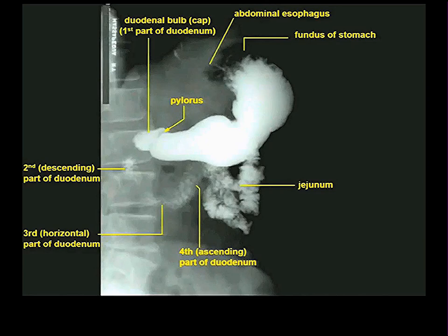It's funny that you should say stomach, which is the correct answer, but give an answer saying the fundus is anteriorly positioned. If they were lying on their stomach, that's where the barium would settle, into the most anterior region. And in fact, they are lying on their stomach, and it has settled into the most anterior region. And the most anterior region of the stomach is really the pyloric antrum. The most posterior region of the stomach is the fundus.